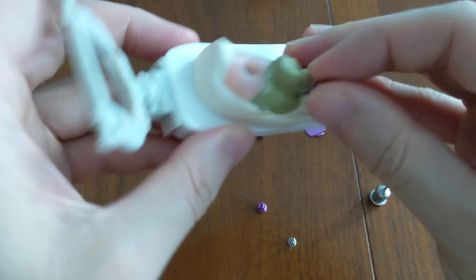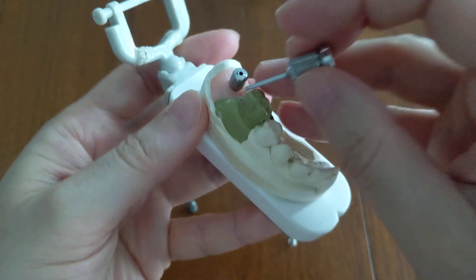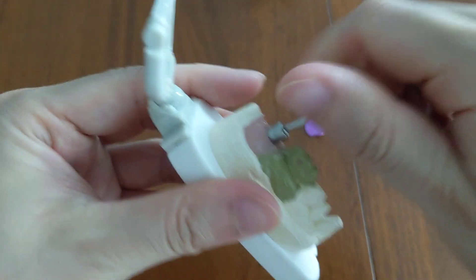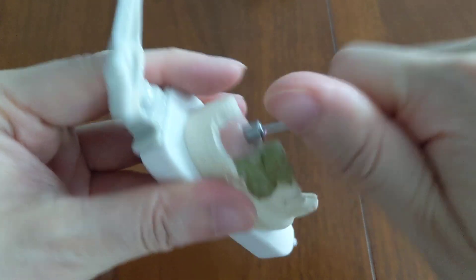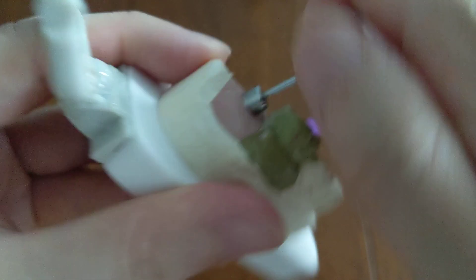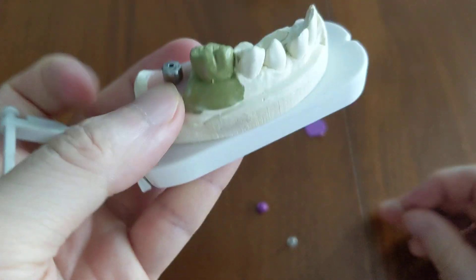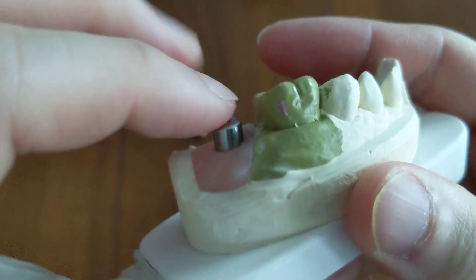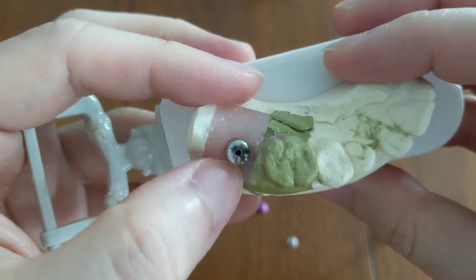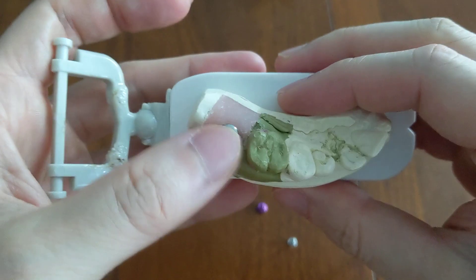What the healing abutment does is it does not get submerged underneath the gums, because it is meant to be a lot longer and is supposed to stick above the gum line. Even when screwed all the way down, you can still see it. That is the defining attribute of having a healing abutment in your mouth — you can see it, you can feel it, and you can touch it with your tongue.